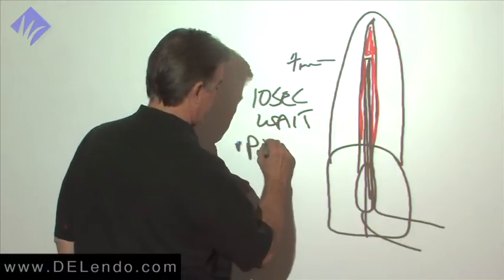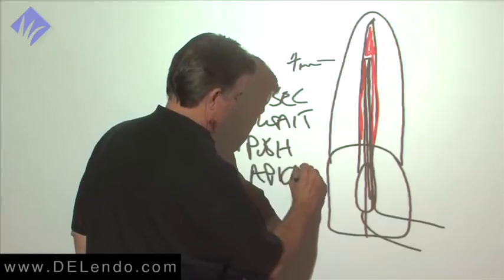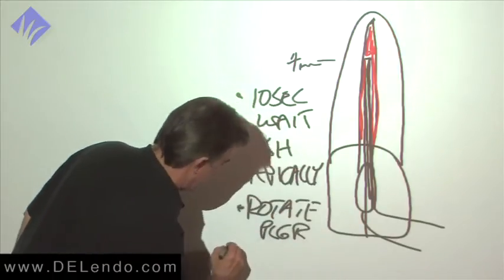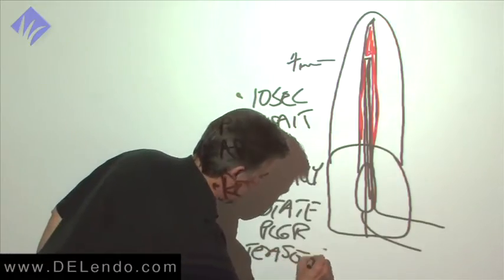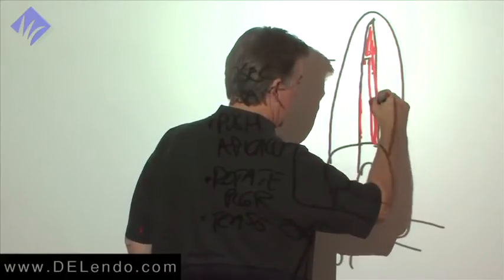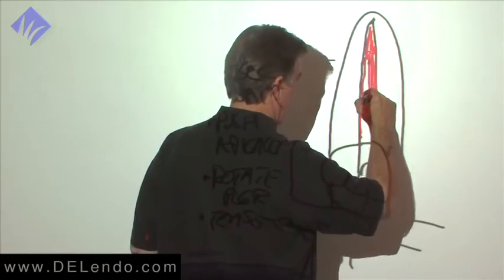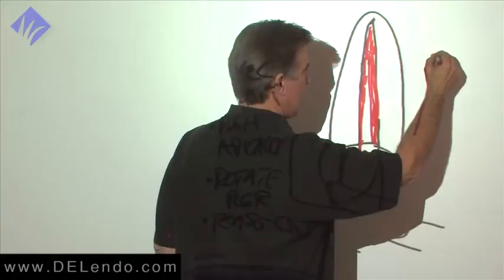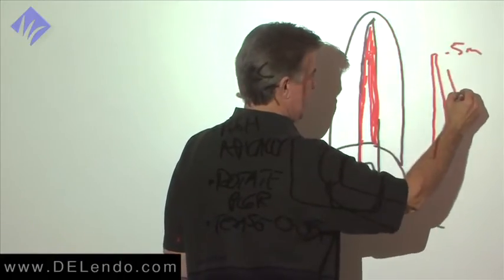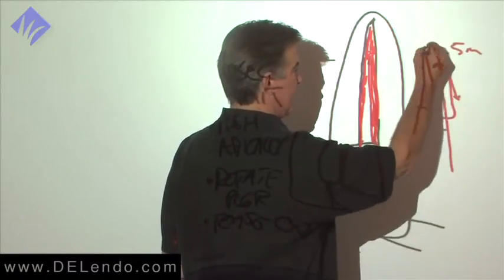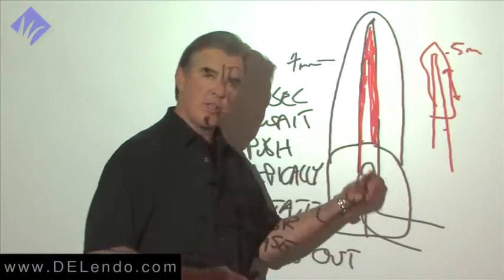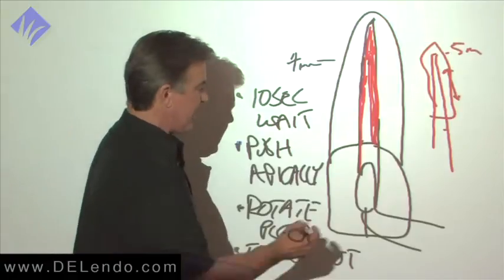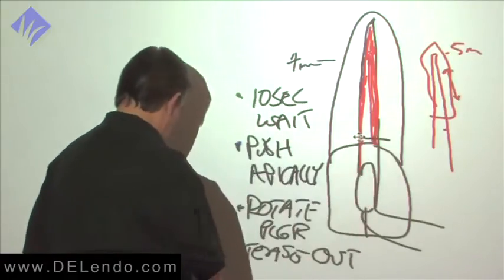Ten-second wait. We push into the edge apically and we rotate the plugger to break it loose, and then we tease it out. We're left with the space of the exact shape of the plugger. The apical region of the canal, the shape of the plugger, we can match that with a backfill cone. It's 0.5 millimeters at the tip. It has the same taper as the plugger did. And we coat that with sealer, and we simply put a backfill cone into the space. Move the cone back and forth, pull it out, make sure it's coated to the end. If it's not, put a little bit more on there. Take it to place. We then use the electric heat carrier and we sear it off at the orifice, condense there, and we have the whole canal filled.